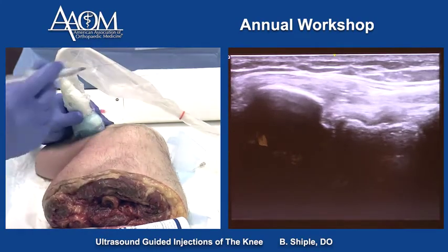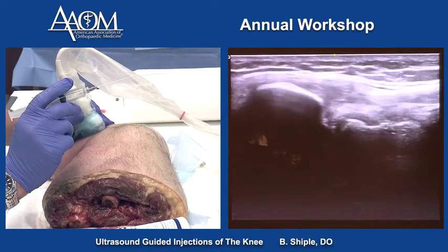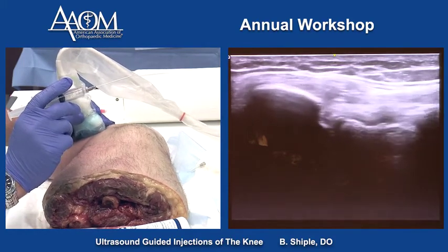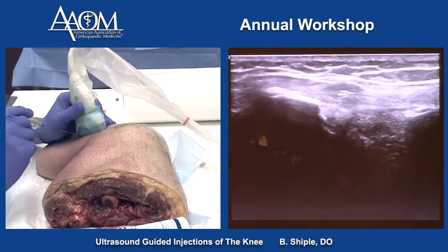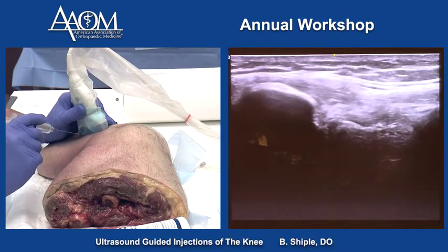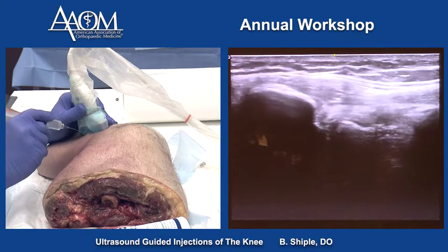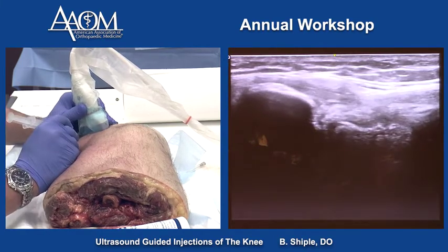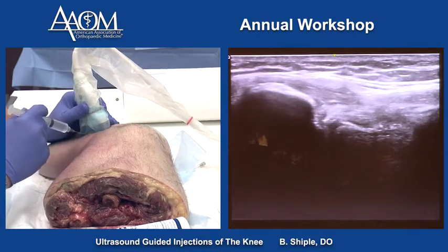If we wanted to get into the tib-fib joint, the proximal tib-fib joint is right in the middle of the screen. We can access that for an unstable tib-fib joint in short axis. I'm in the joint right there, and we can put a little fluid in there.